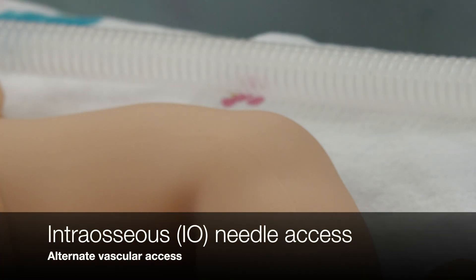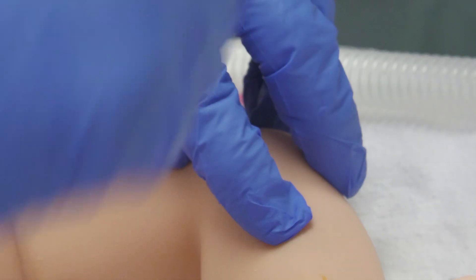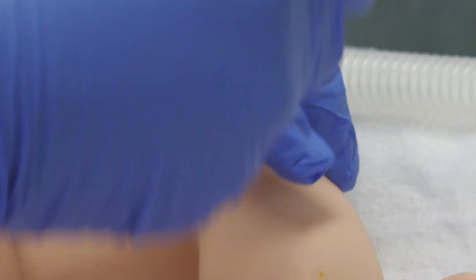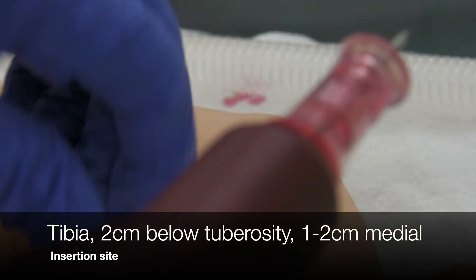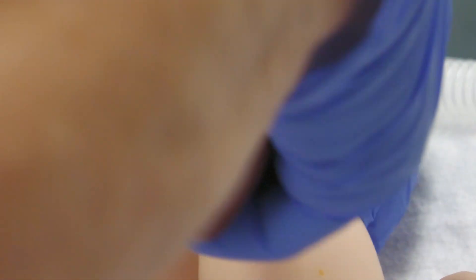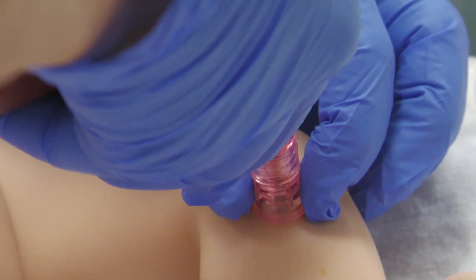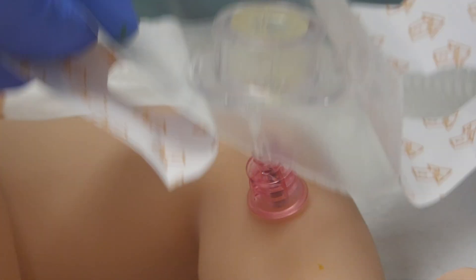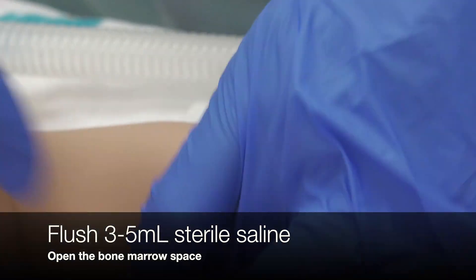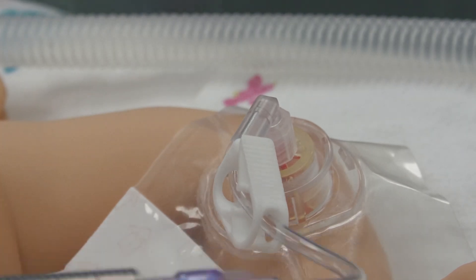If umbilical access is not possible, an alternate route for intravascular access is an intraosseous needle. Identify the insertion site on the flat surface of the tibia, approximately 2 centimeters below the tuberosity and 1-2 centimeters medial. Clean the site with antiseptic. Hold the IO drill perpendicular to the skin. Pull the trigger while holding downward pressure. Secure the needle, connect the infusion set, and flush 3-5 mLs of sterile saline to open the bone marrow space. This can now be used as any other IV access site.